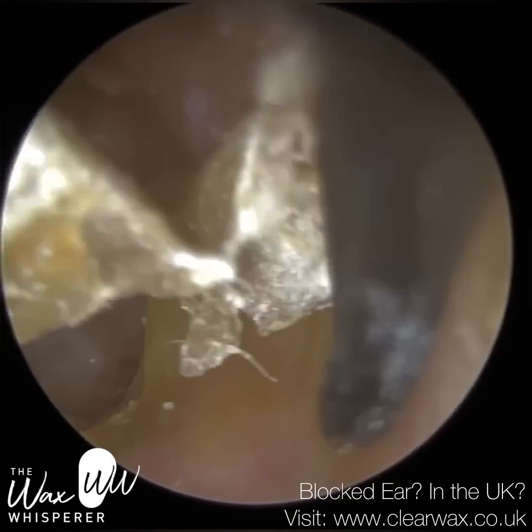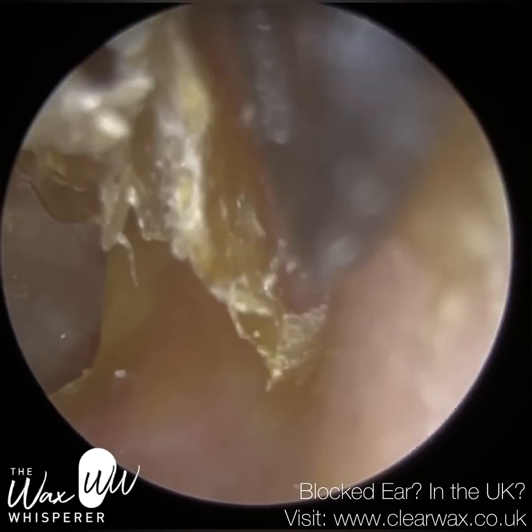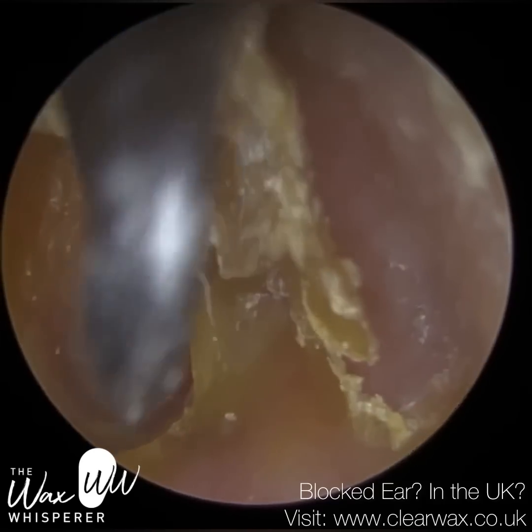And I wouldn't have been able to do this with the previous Jobson horn I was using. So this is the new curette that I've developed. It's got a tapered tip. It's also got a curvature that mimics the curvature of the ear canal. It's worked really, really well there.